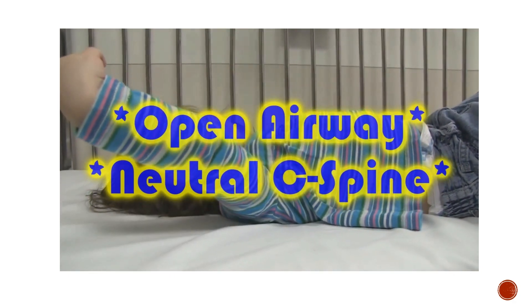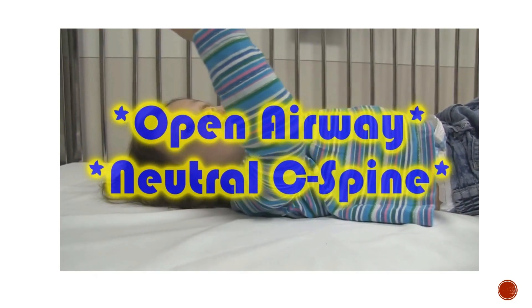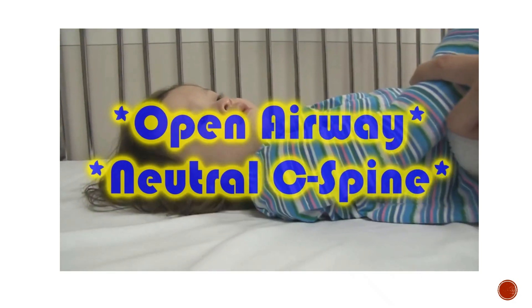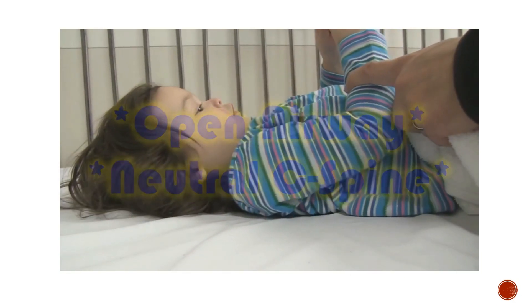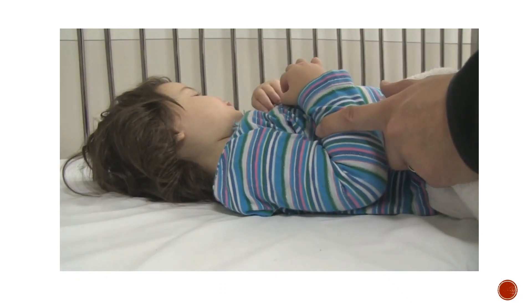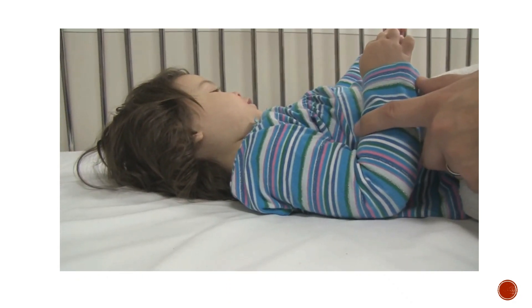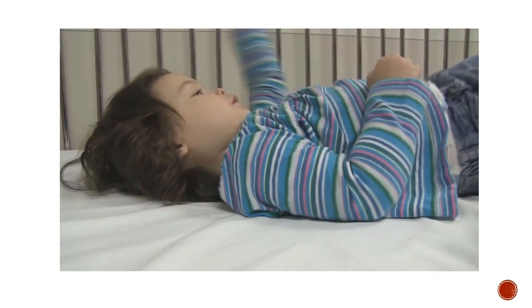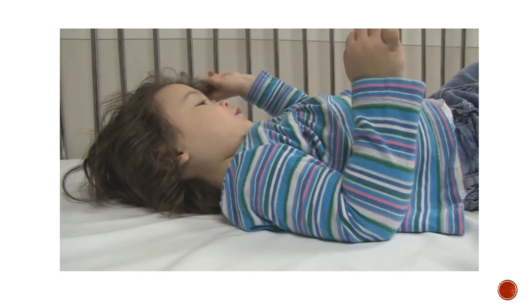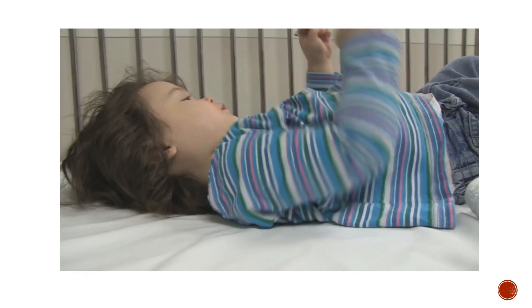So, what we're going to do today is demonstrate the benefits of putting a towel underneath the shoulder. When children are laying flat on a backboard, or if you're getting ready to intubate, the alignment is not perfect. Putting padding under the shoulders will give you more of a neutral C-spine and will get rid of that anterior flexion you see because of the large head.